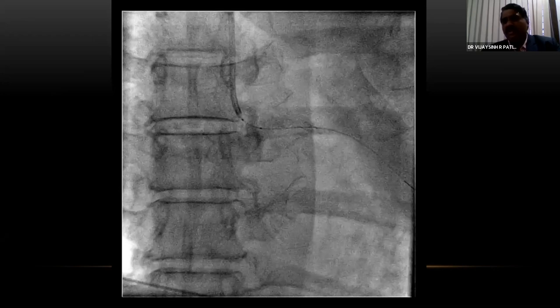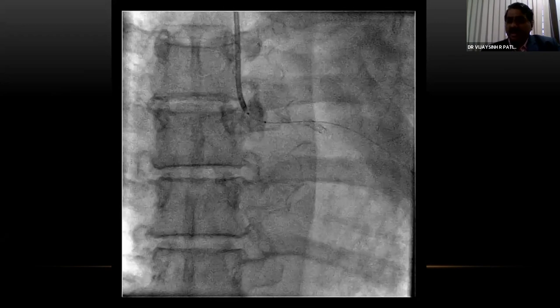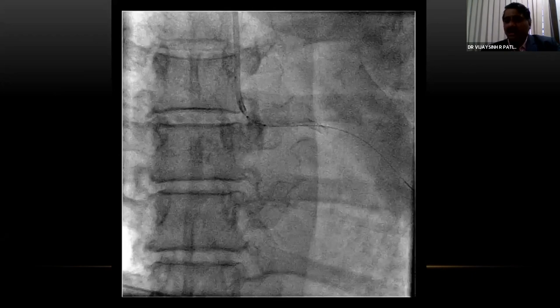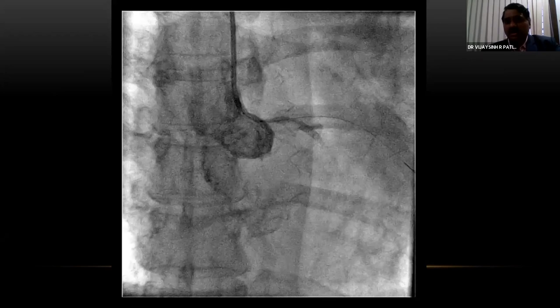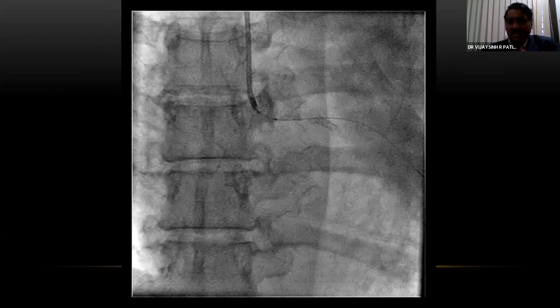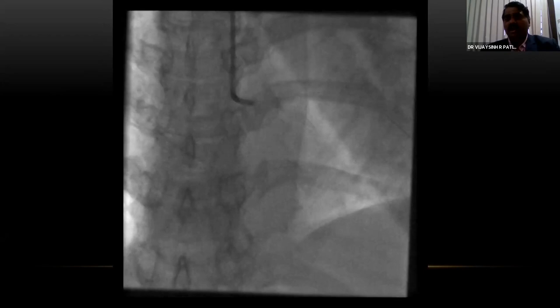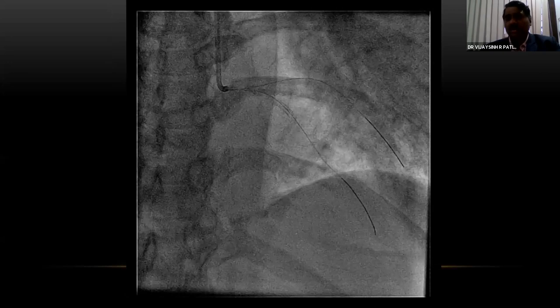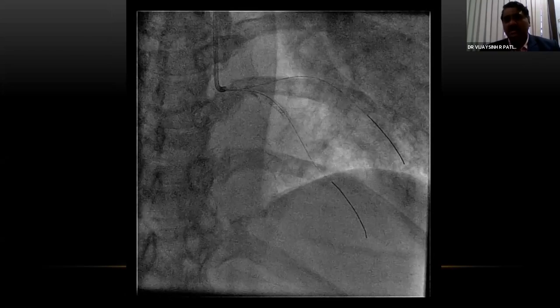Balloon immediately dilated at the left main ostium, and intracoronary adrenaline was repeated. Some rhythmic contraction started. We had a pressure of around 60 millimeters, and then the wire was repositioned from the OM to the LAD. We dilated this again with a 2.5 by 10 non-compliant balloon, thinking that it would be a fibrotic lesion. The patient again had a hemodynamic crash after the second dilatation, requiring intracardiac adrenaline and intracoronary epinephrine. A second wire was placed in the left circumflex.